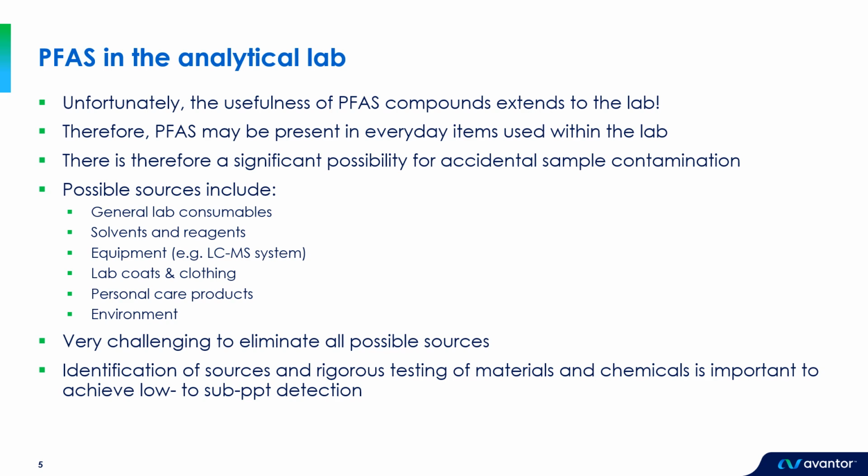Our lab coats, along with clothing that we bring into the lab, could be potential sources, along with personal care products that we use as well. So items like lotions, cosmetics, and hand sanitizers could also be potential sources. The general lab environment, including work surfaces and air passing through the air conditioning filters, can potentially also be another source.